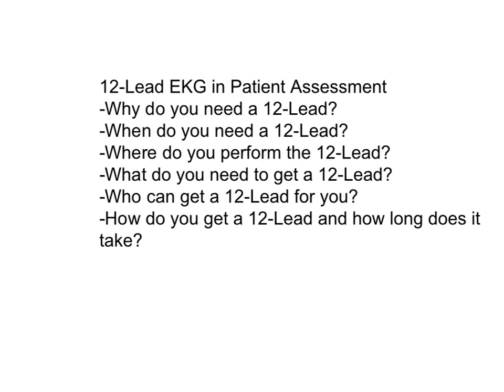Why we're doing this, we're going to do several more of these presentations about the specifics of analyzing a 12-lead and all the information that you can obtain. We're looking in the 12 leads for evidence of injury, ischemia, or infarct. We're also looking for conduction delays. We're also looking to get an excellent view of what the actual rhythm is. In some cases it's difficult to tell from one lead, but you can certainly get a better look when you get 12. So that's just the start of several in a series on 12-lead EKGs.